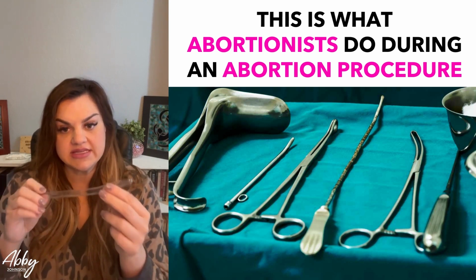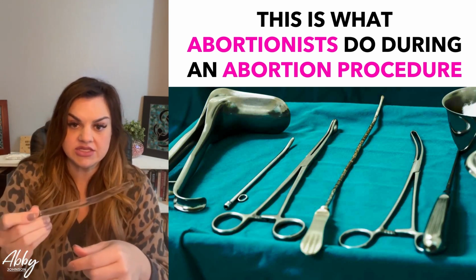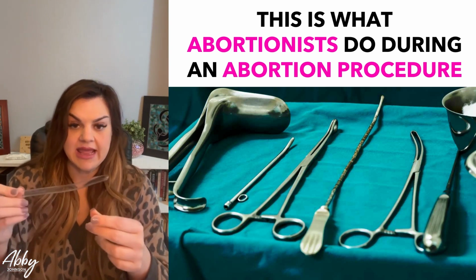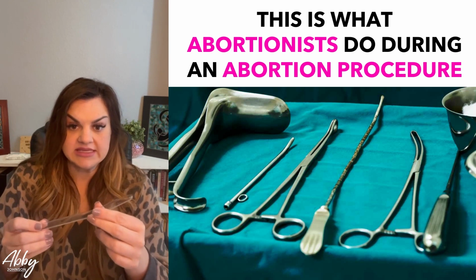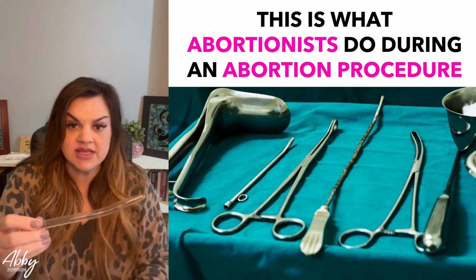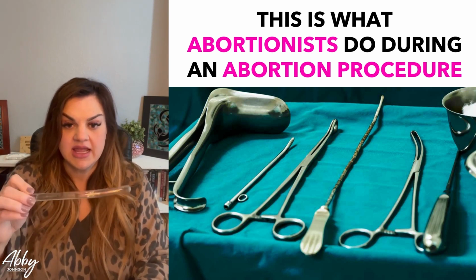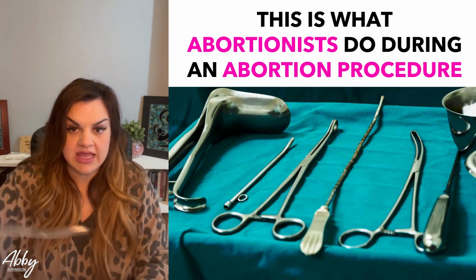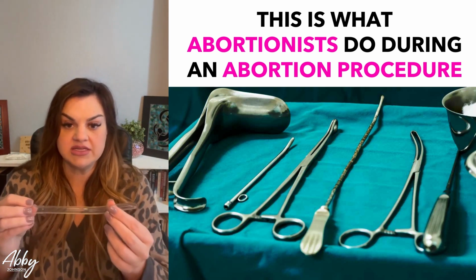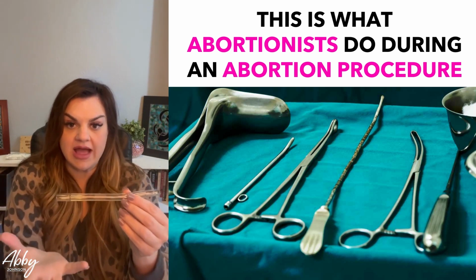And so they take this hard piece of plastic, and this is what they actually insert into the woman's uterus. And they will take this and they will blindly sort of poke around into the woman's uterus, and they'll take this and twirl it around like this. And then they'll keep poking in and out until they feel like they have enough blood and tissue suctioned through this tube and into a glass jar.